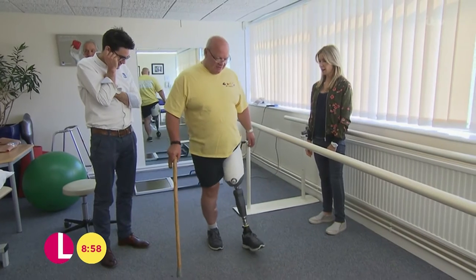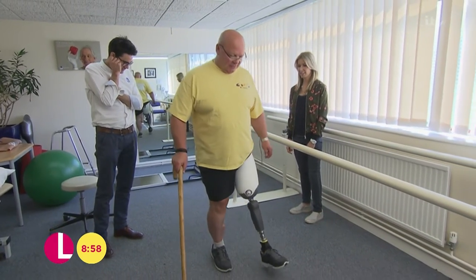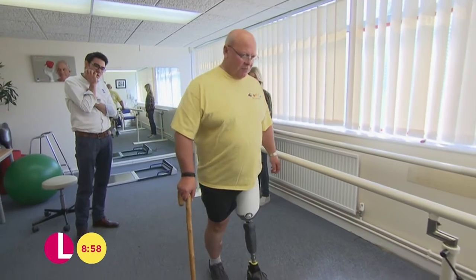It's amazing. He got his iPad out and started saying he's going to program the knee using his iPad — setting the level of resistance and everything. That's a real feat of engineering. It's like magic, it's like smoke and mirrors, and this thing vibrates when he sets it off — it's incredible.